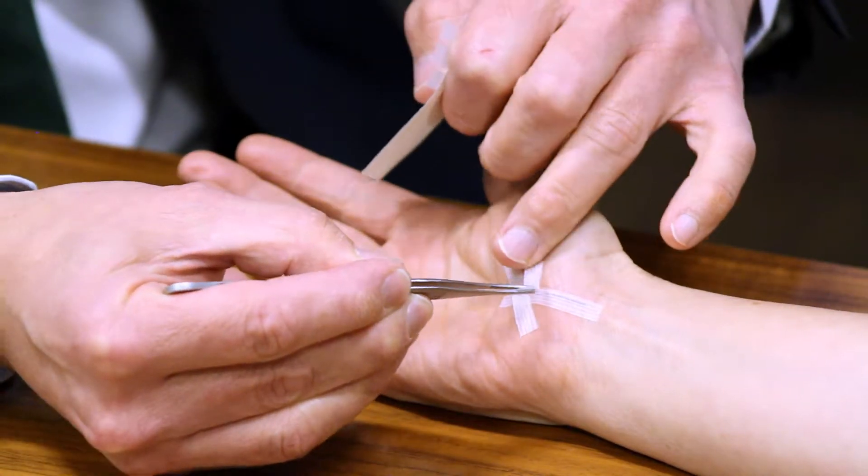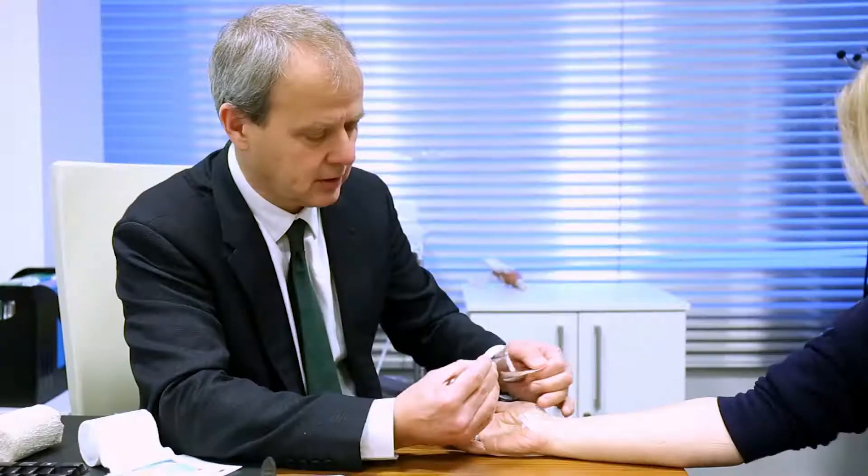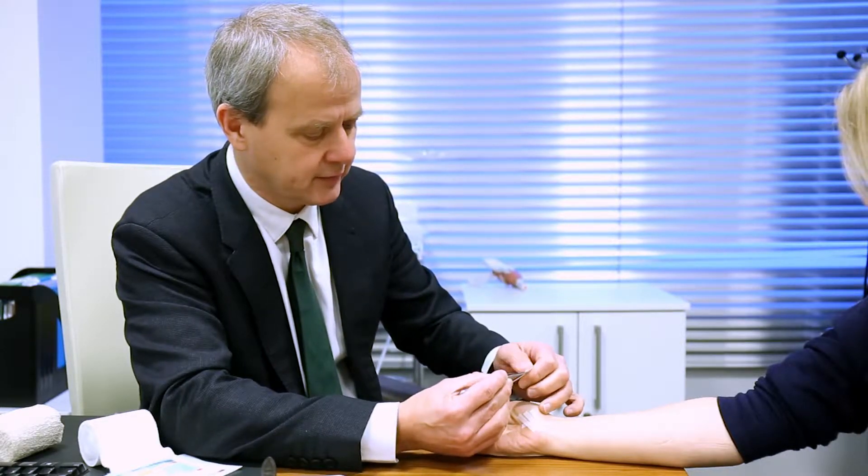These Steri-strips are really useful at giving a good cosmetic result afterwards. And you can just peel these off yourself at 72 hours after the surgery.